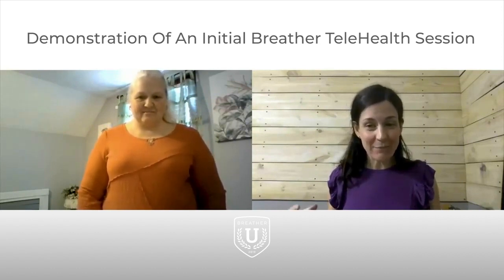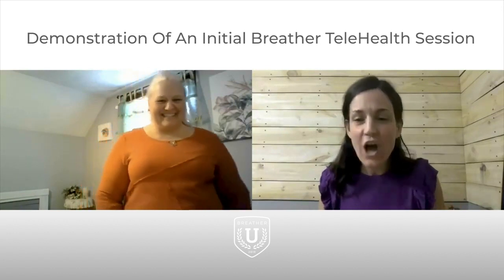That's perfect. So with a TV show, a nice way to put that big break in between is just do a set when the commercials come on. Oh, so don't fast forward through the commercials. Or start your breather and then fast forward. So watch the chunk of show, commercials come on, pick up your breather, do 10 reps. Then watch your show, next time commercials come on, do 10 more reps. That's a beautiful long break in between. Okay. So let's plan on doing that.